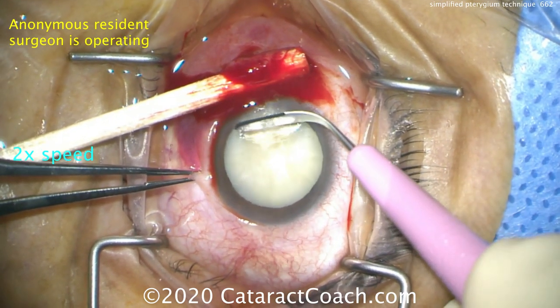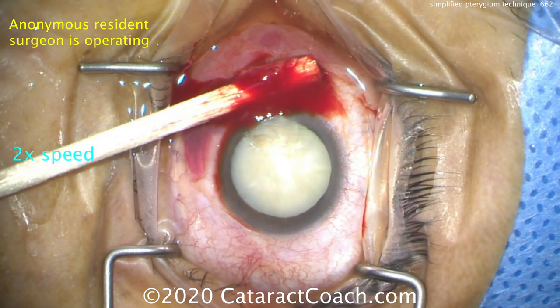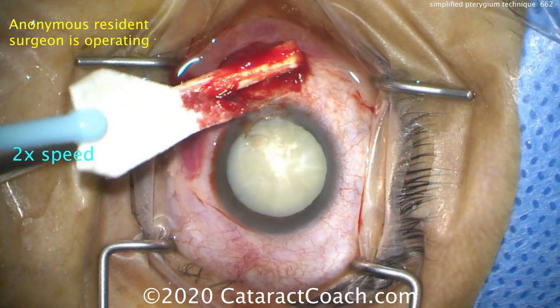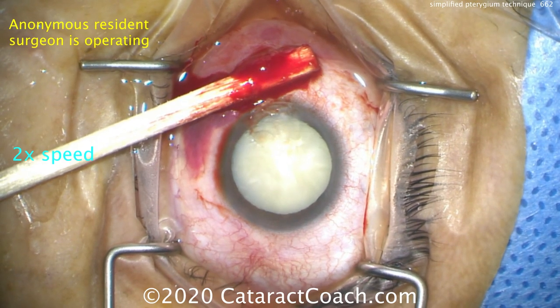First, do no harm. The cornea is only about 500 microns in thickness, maybe 600 or so at the periphery here. We just want to remove enough so it's smooth — you're not looking to remove all evidence of opacity. So that looks pretty good.